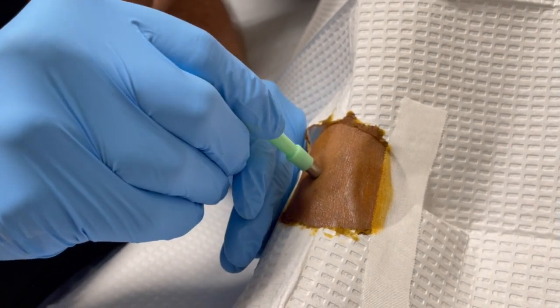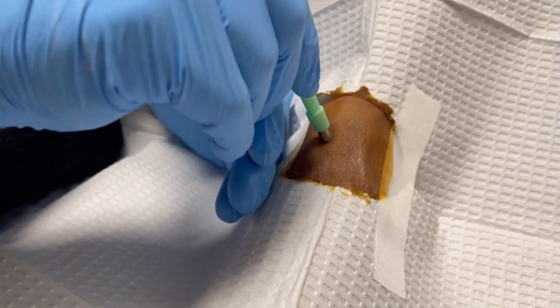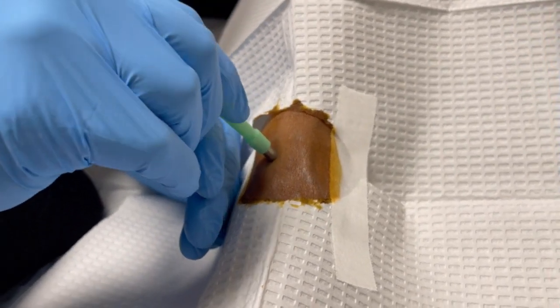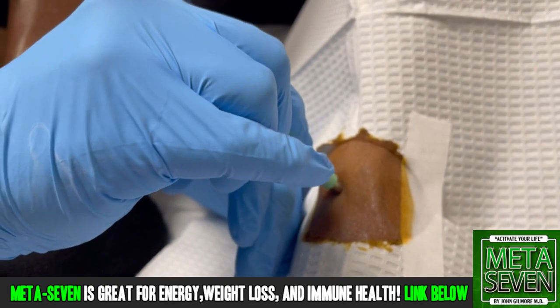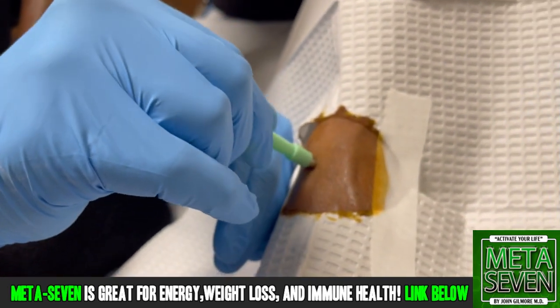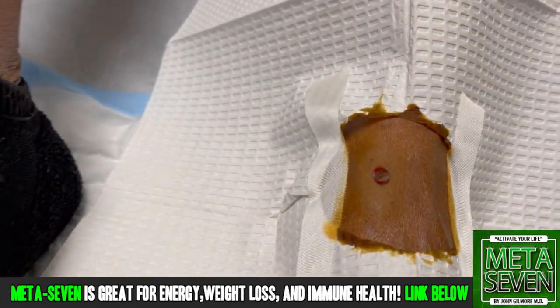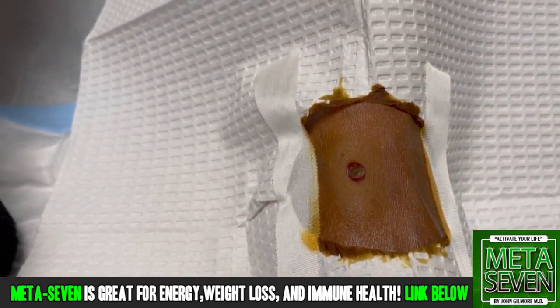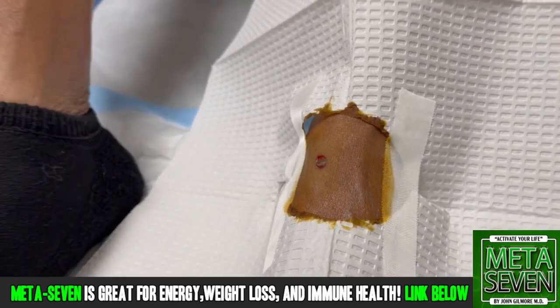How about now? Nope. Good. You might feel just a little pressure here. We don't have to go very deep — it's a dorsum of the foot, so the skin is a little thinner. But we do want to get a complete incision. Here we go. I don't want to take any tendons or anything, right?